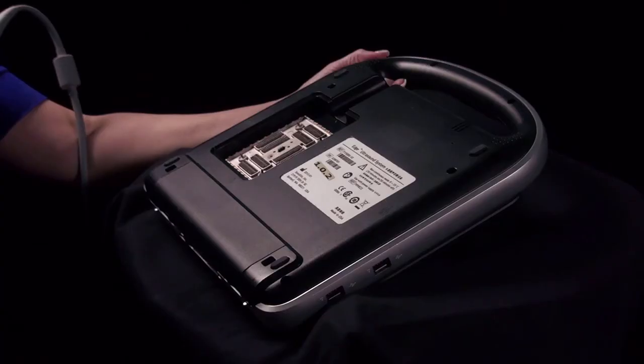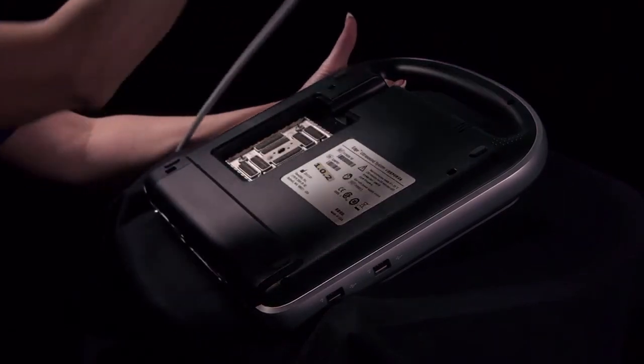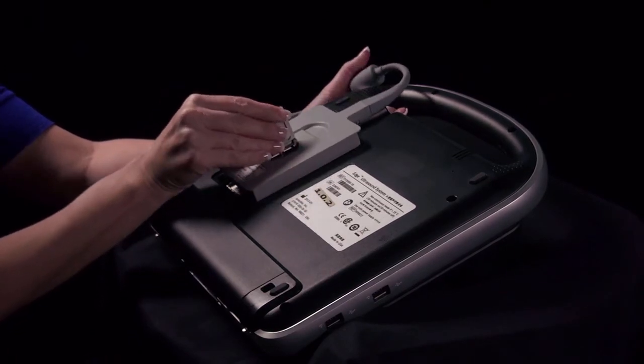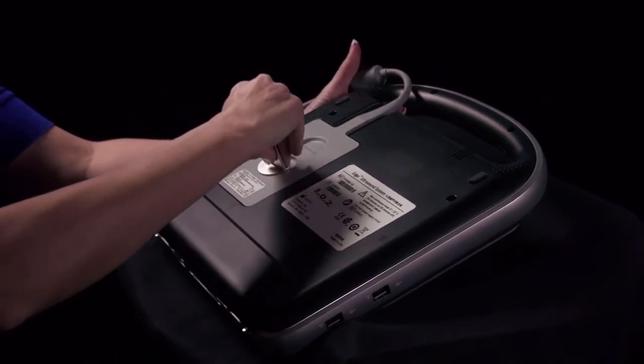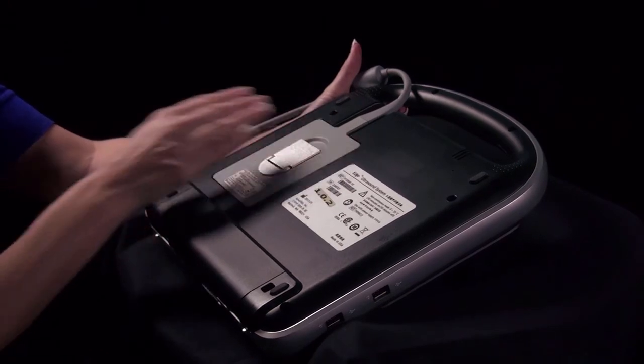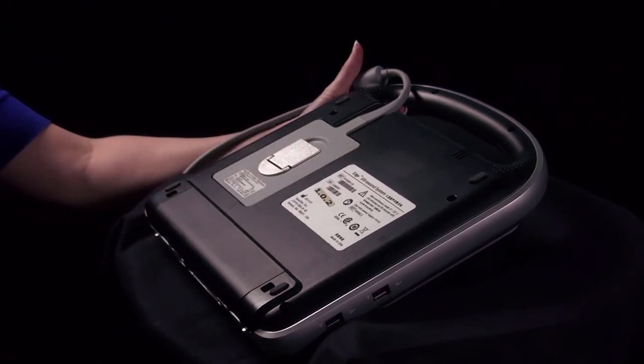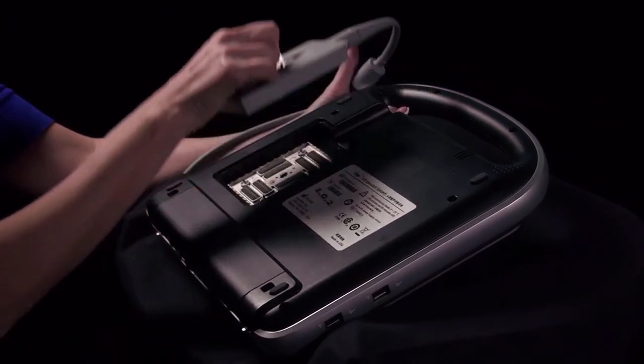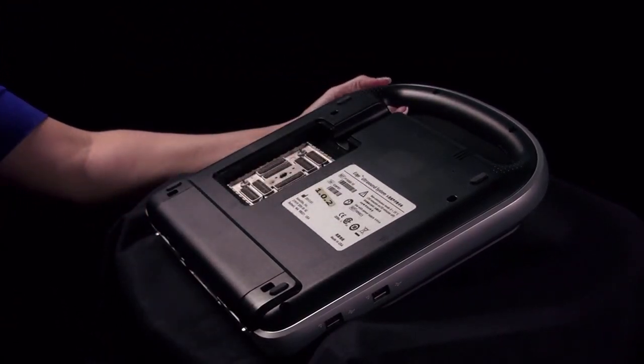To connect a transducer, turn the system upside down. Pull the transducer latch up and rotate it clockwise. Insert the transducer connector. Turn the latch counterclockwise and press the latch down. Pull the transducer connector away from the system.